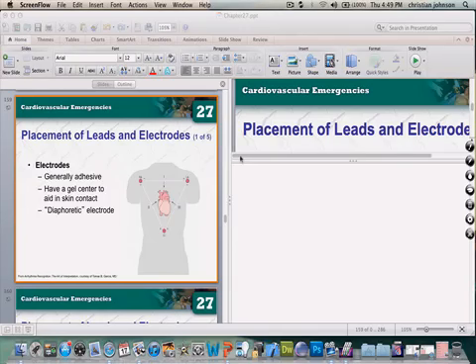Alright guys, getting right into EKG basics. The starting point of what we need to do in order to start recognizing our EKGs is to understand some concepts of EKGs. We're going to start with the all important Einthoven's triangle, an important concept to get down when you're talking about polarity and how the EKG is going to read and interpret.